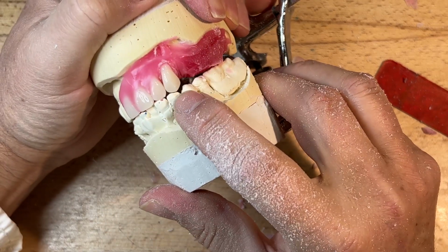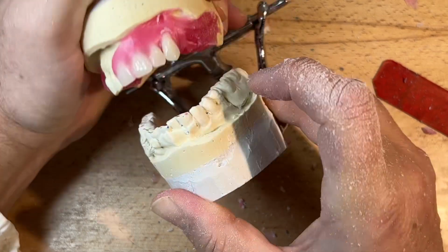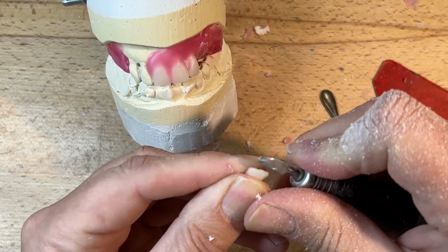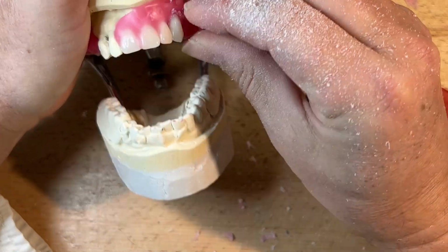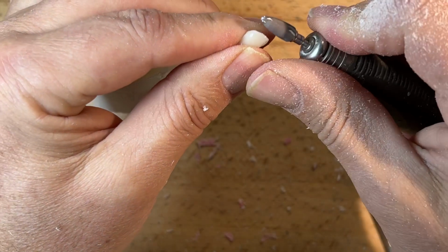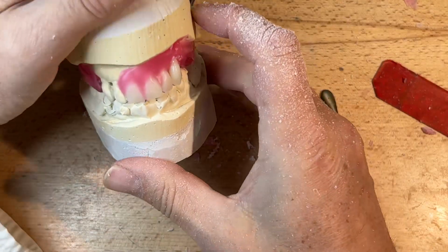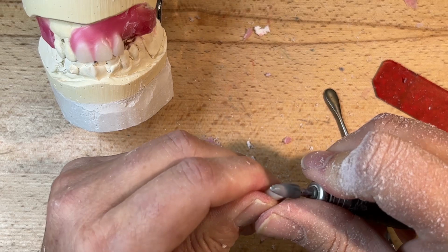And here we're creating this type of edge-to-edge relationship. I don't want to have a cuspid-guided disclusion in the posterior. I mean, this would not be advantageous for denture stability. Denture stability is when the patient is chewing or in lateral excursions left and right and protrusive, that we try to minimize this kind of denture movement, minimizing denture sores, maximizing stability without compromising on the retention that we're going to achieve from our denture here.